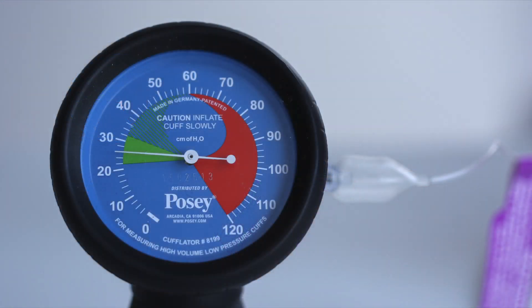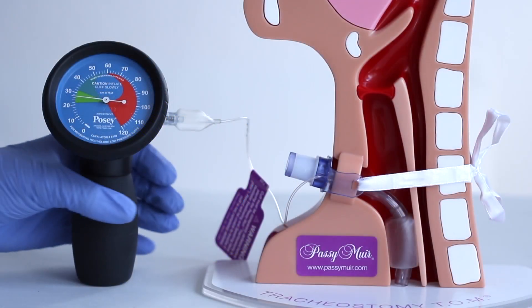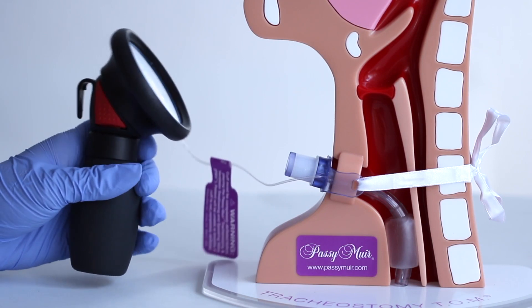To properly seal and measure cuff pressure, attach the manometer to the pilot balloon of the tracheostomy tube. Squeeze the inflator bulb to add air and pressure to the cuff while watching the needle on the manometer increase to between 20 and 30 cmH2O.